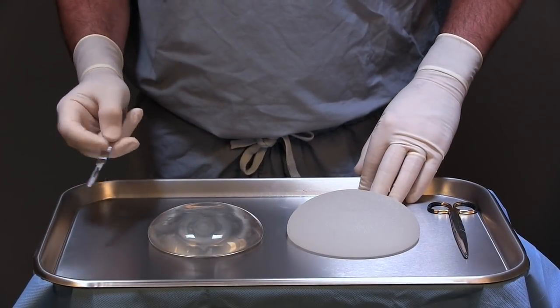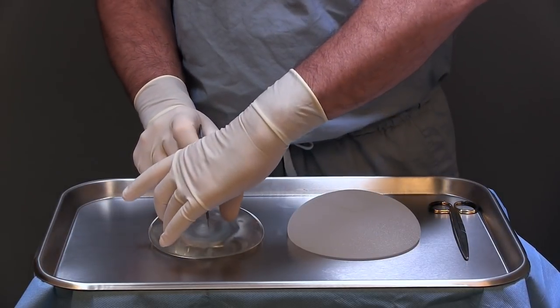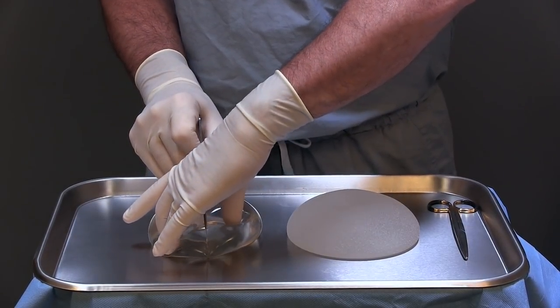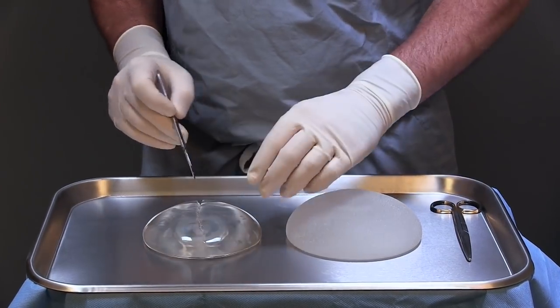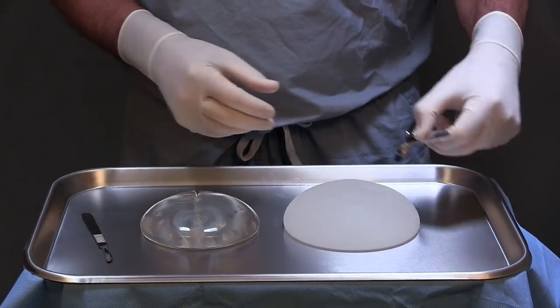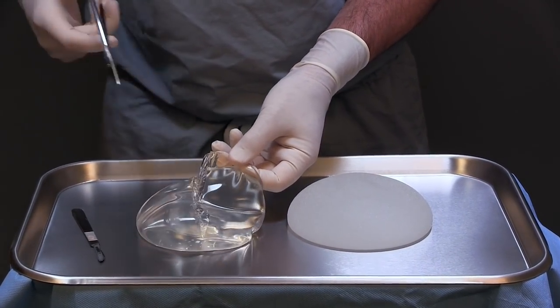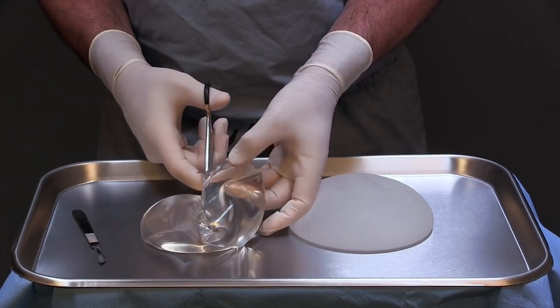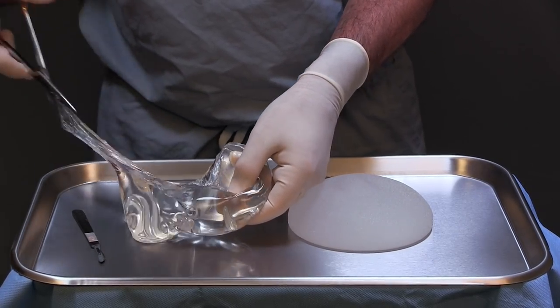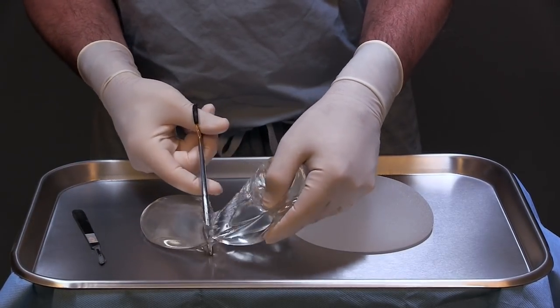First, I'm going to cut a cohesive gel implant in half. These implants have been available since about 2006 and they're pretty good implants. They're supposed to be a material that will not ooze or flow all over the patient, and therefore shouldn't be absorbed by the patient's body. This was obviously a big advance over the liquid-style implants that were available up until the 1990s.